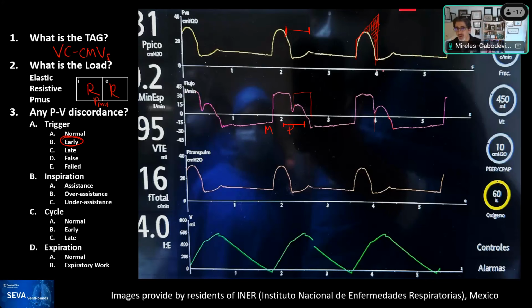In general terms, the way that we deal with this, especially with a patient with such a high resistance, would be how? How would the team deal with this reverse trigger? Yeah, Megan, what would you do? Yes, drop the respiratory rate. Great job, Arcel. So these are patients in which we would drop the respiratory rate as much as possible, so that this patient is coming out of sedation or is on sedation, and these are the manifestations of sedation, and let them start driving the rate themselves. And so that may be the next step.